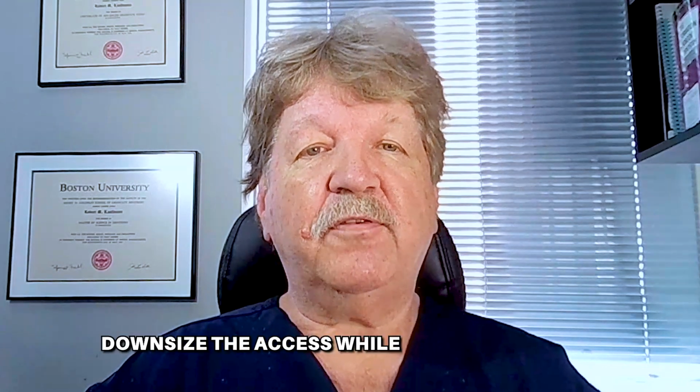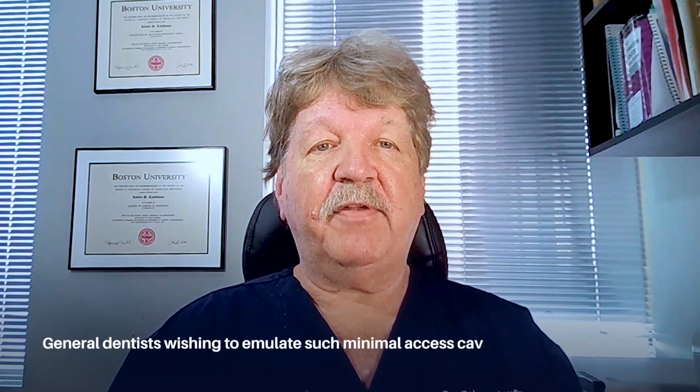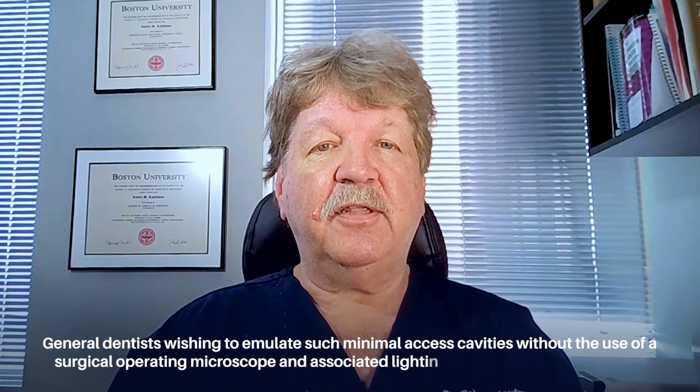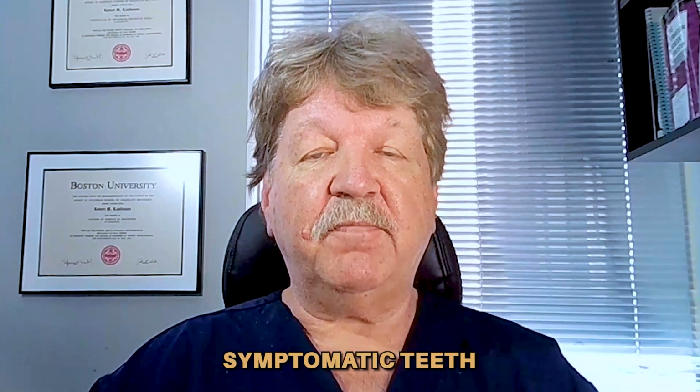Whereas in the past, endodontists tended to open the access to allow for better visibility, the surgical operating microscope has allowed us to downsize the access while still maintaining optimal visibility. However, general dentists wishing to emulate such minimal access cavities without the use of a surgical operating microscope and associated lighting are going to miss anatomy, and this will result in symptomatic teeth.